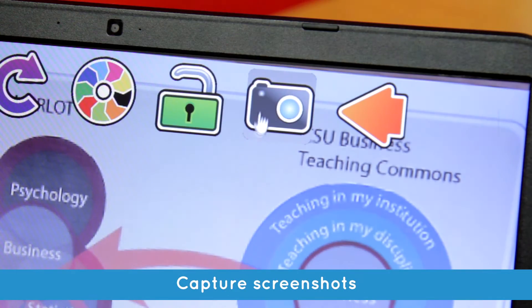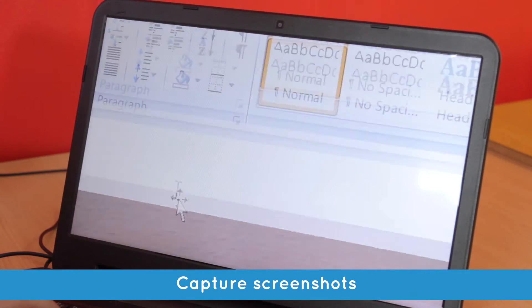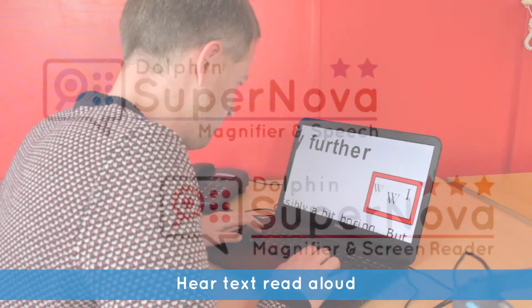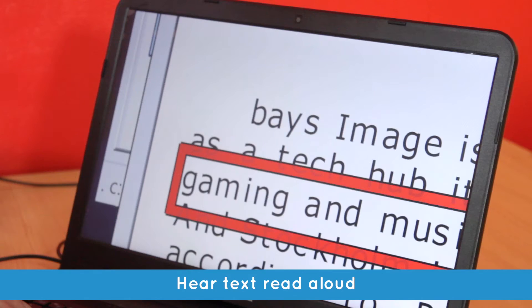You can even capture and save the image to add to your notes or for further exploration at a later date. Choose Magnifier and Speech or Magnifier and Screen Reader and hear the text under your camera read aloud, thanks to the scan and read feature included in both editions.